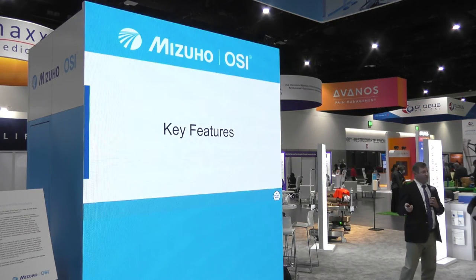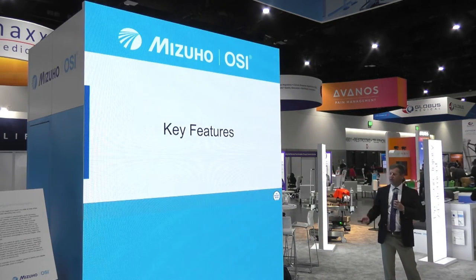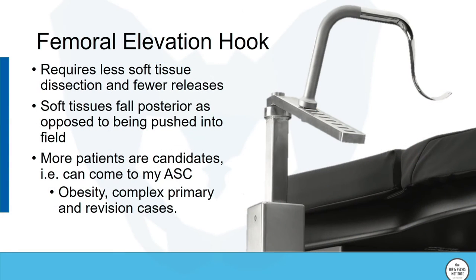So the key features, I think still the most important thing about the Hana table is this brilliant idea, which was to lift the femur from inside the wound. That's a beautiful way of doing it because it reduces the amount of soft tissue dissection required. It allows the soft tissues of the hip to fall posteriorly, which allows excellent exposure.